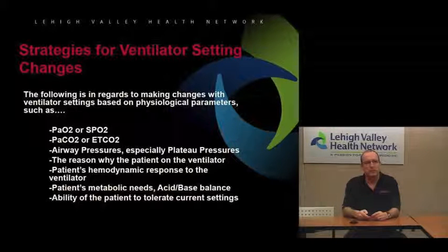Sometimes people drop their blood pressures if their airway pressures are too high. Some patients that might be on the dry side or are having preload problems might not tolerate higher volumes or higher pressures. You also want to consider the metabolic needs, their acid-base balance. If somebody's profoundly acidotic and we try to give them perfect numbers, for example, we're not really doing the patient any favors. In fact, we're probably hurting the patient.